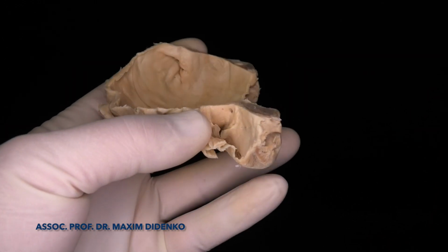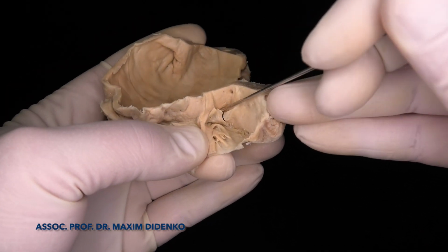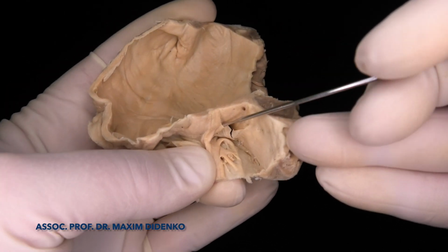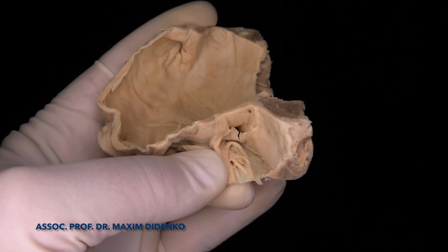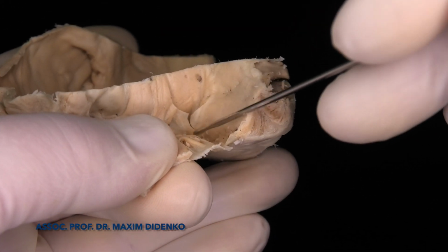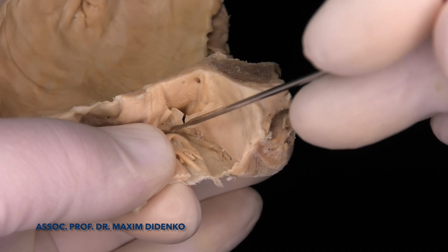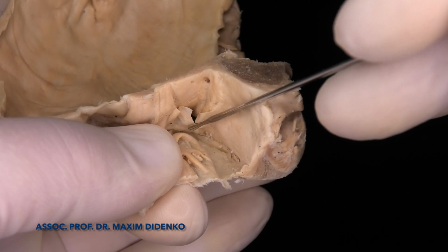The Thebesian valve, and we can see this fibrotic tissue here, almost fully covers the entrance to the coronary sinus ostium.